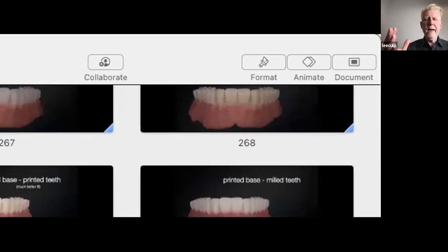So we have to add Connect to the PMMA to get the resin teeth and the resin bonding agent to stick to the PMMA. So Connect just allows light cured resins to stick to conventional PMMA. It connects to dissimilar resins. Yes. I think that's a good way to say it.